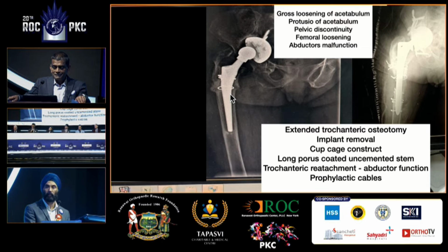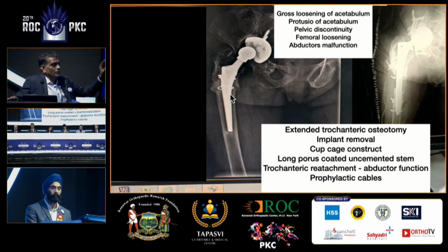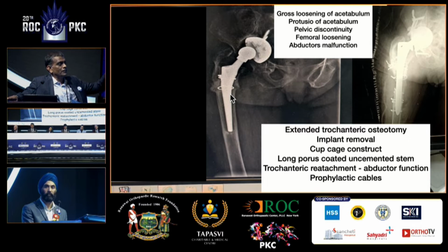They make both now, different companies do. I think the screws are very important because the cup needs to be stable for it to ingrow. You can't leave a cup floating in air. And then, of course, you've got a good hemi cage. And as Dan said, as much fixation as you can, and then you will get osseointegration.